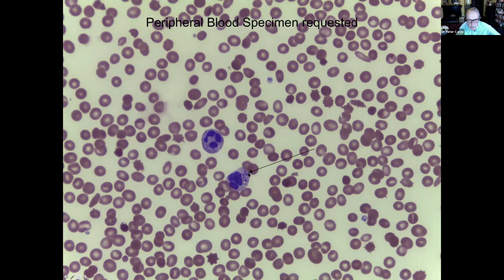So leishmaniasis is transmitted by the sandfly, the phlebotomine sandfly, from the Greek, cutting for veins. This is a professional blood taker. And the meal, rather like with malaria, is transmitted from the gut of the insect into the bloodstream. And if you think about it, it's very rare to see them in the peripheral blood, but they must be in the peripheral blood, otherwise the disease wouldn't exist.